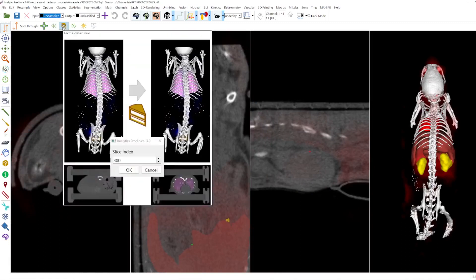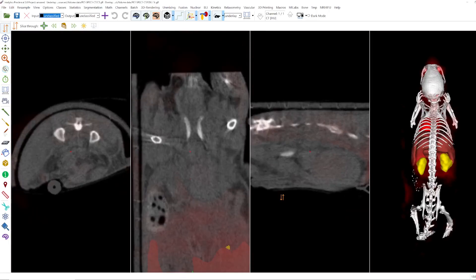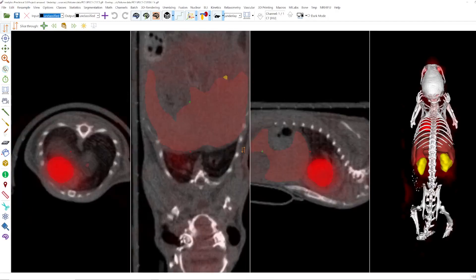With this you can go to a certain slice. You just enter the slice index here, for example 100. Now we are at slice 100 regarding the axial slice view. Or you can go to slice 300 here.